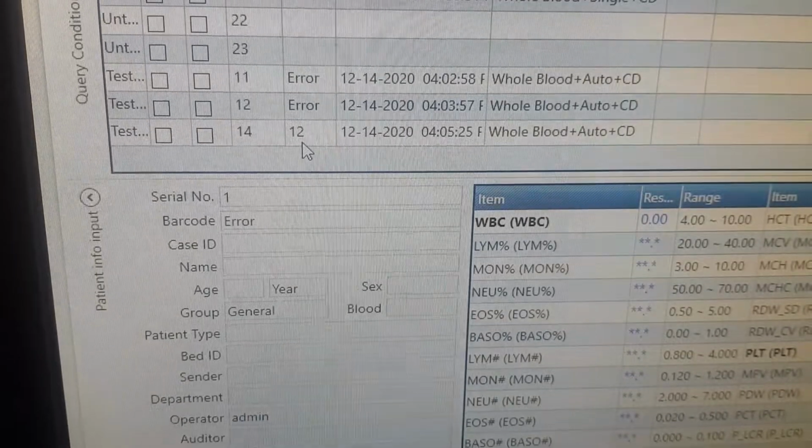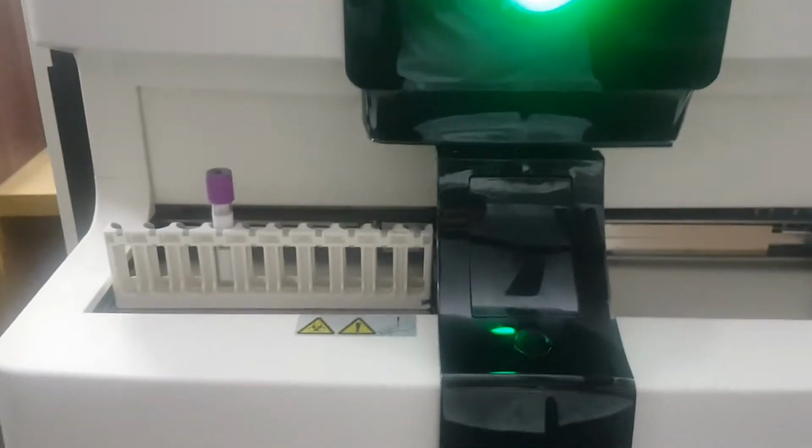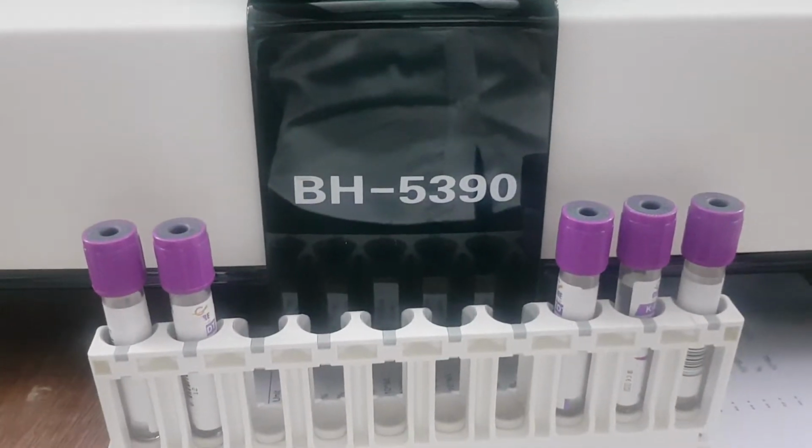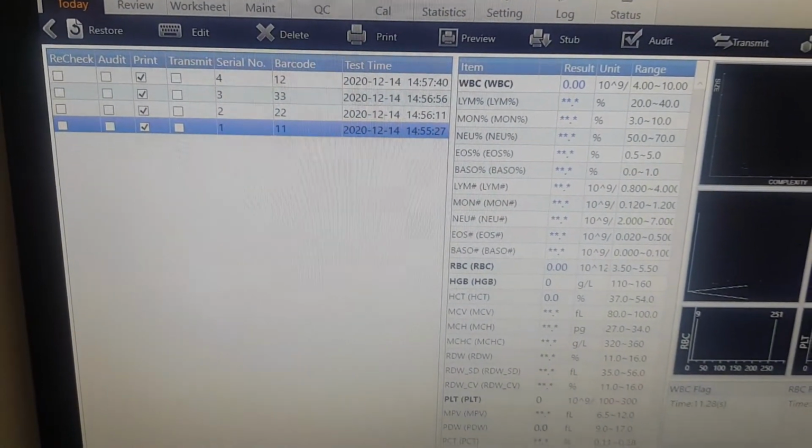But in 5390, when we come to 5390, this software doesn't have that options.